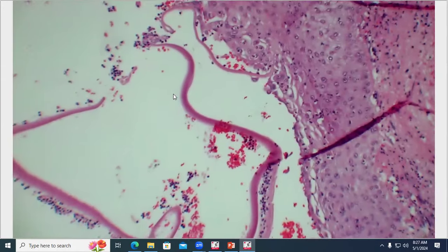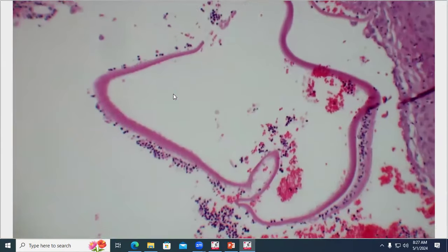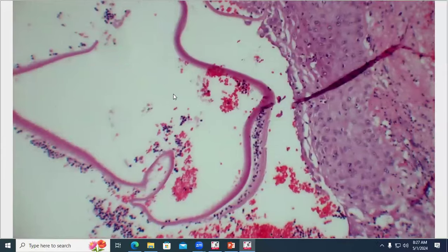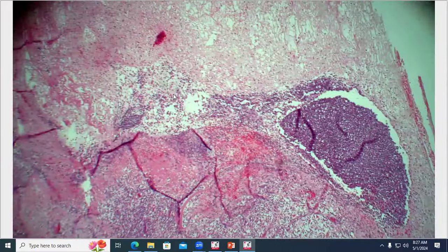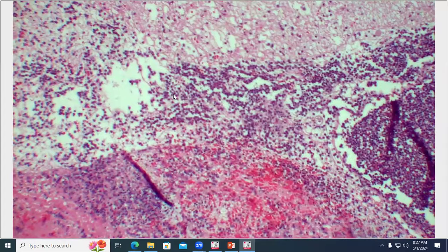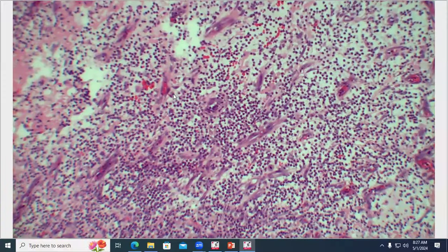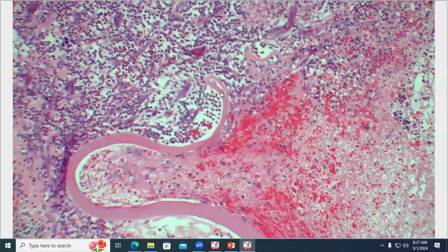there is a fragment of Descemet's membrane kind of outside the eye, which is not where it's supposed to be. When we have free fragments of Descemet's membrane floating around in a corneal rupture, we like to think that it's probably a ruptured descemetocele that's happened. And so here is our fibrin and neutrophils and hemorrhage that's heading into the eye. Here we go. Here is the end of Descemet's membrane, all nice and curled. Lots of fibrin and hemorrhage again.